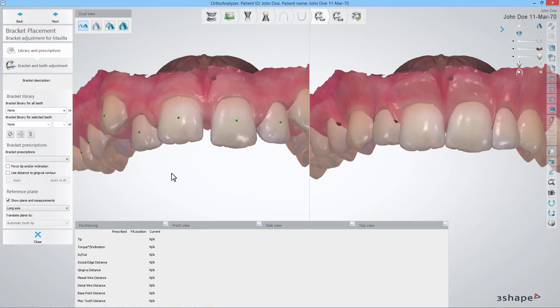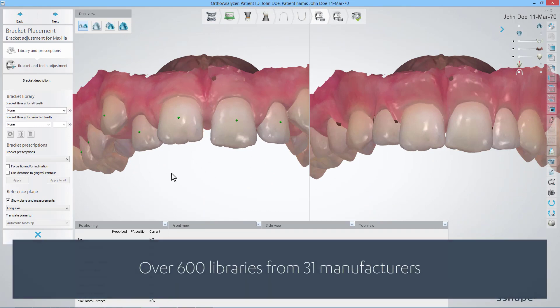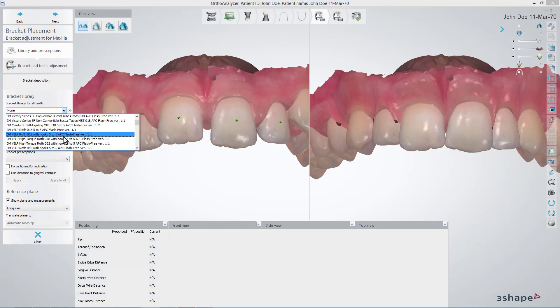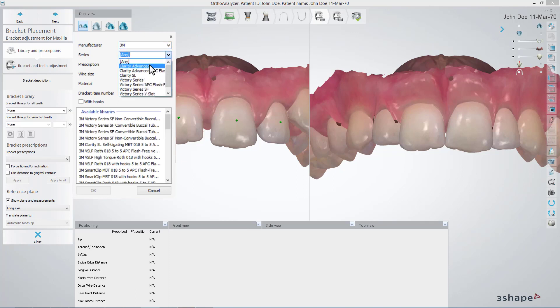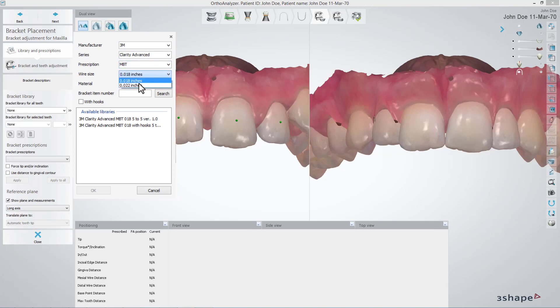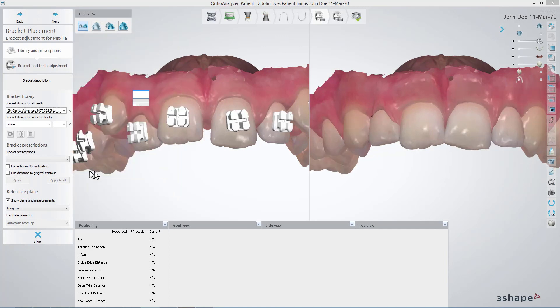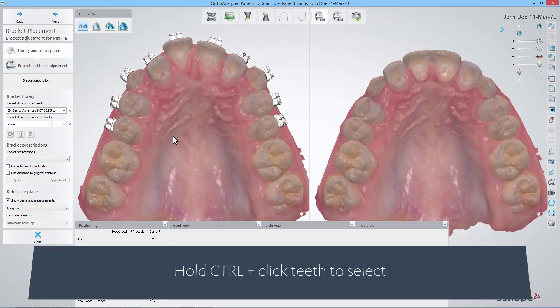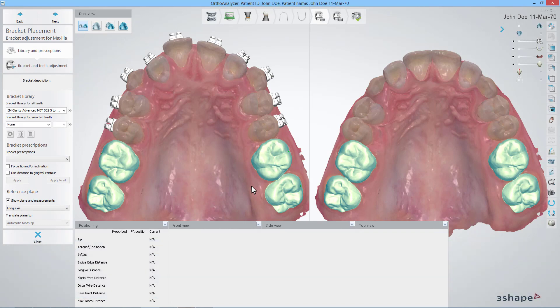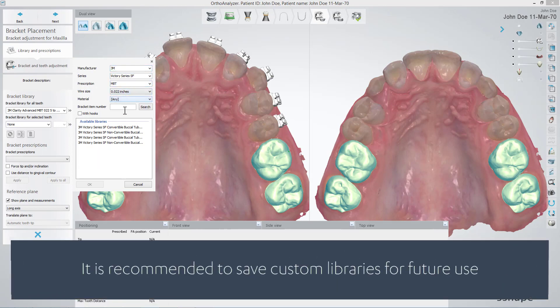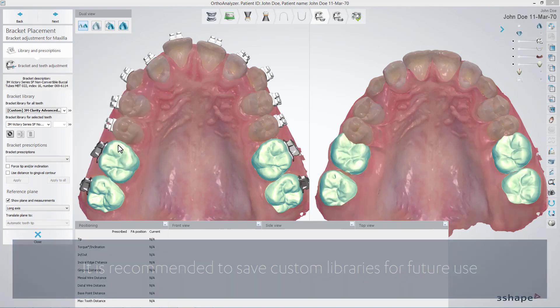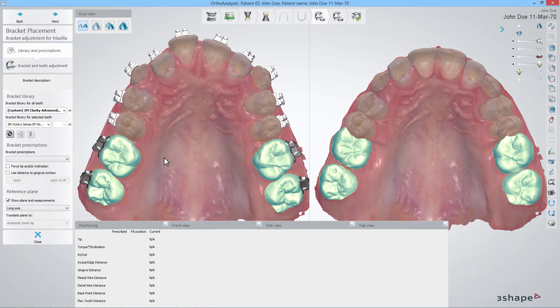In the next step, you'll choose Bracket Libraries for the specific jaw. Click the Bracket Library for All Teeth drop-down to simply select a library from the list. Or you can click the arrow to the right to select a manufacturer, series, a prescription, wire size, a material, hooks included, and then select the right library from a short list. If you want to put a library for specific teeth, for example tubes for molars, hold down the control button and select the teeth. Then select a library from the Bracket Library for Selected Teeth drop-down, or search by parameters. It is recommended that you establish preferred Bracket Libraries containing both brackets and tubes. Click the Save Mixed Bracket Library button to do that.